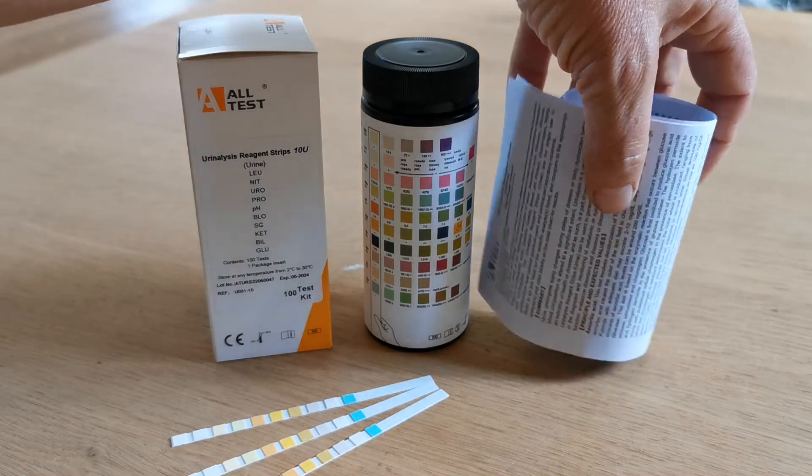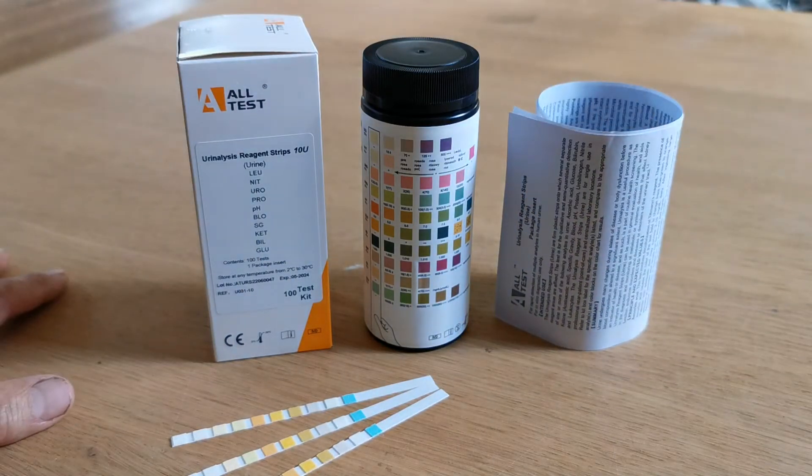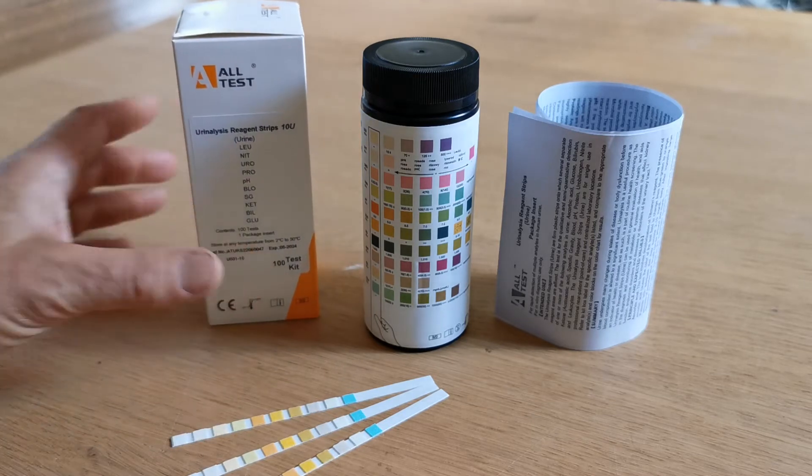Also included in the pack is the IFU — the instructions for use — with all the information from the manufacturer in terms of the specificity, accuracy and overall sensitivity of these packs.